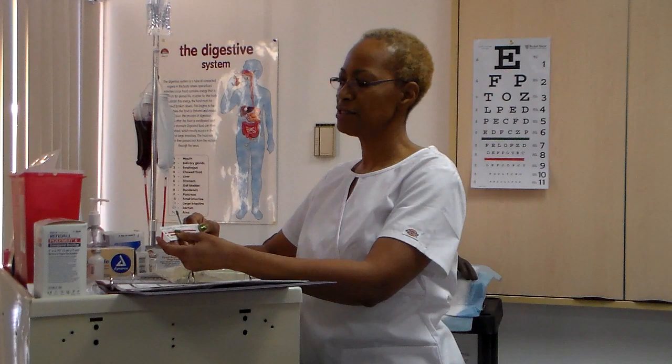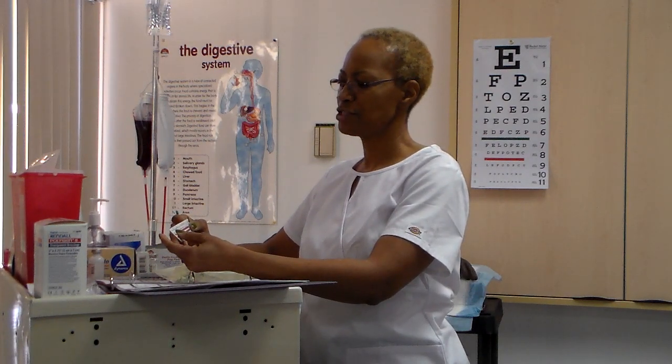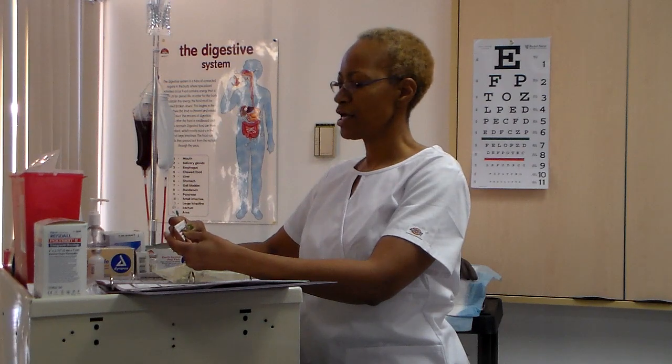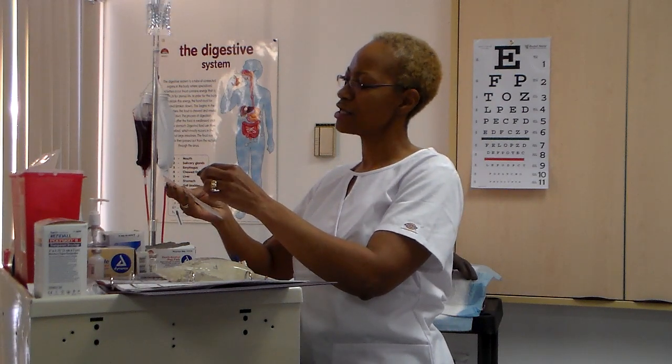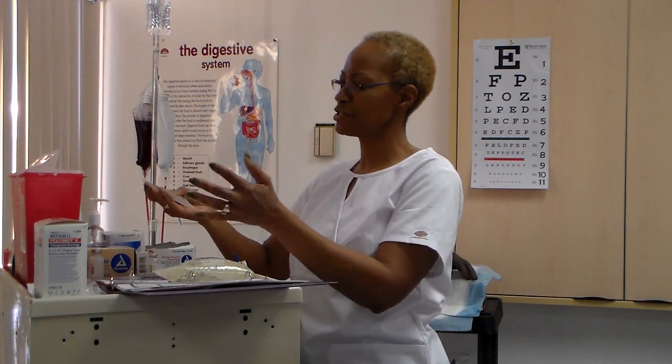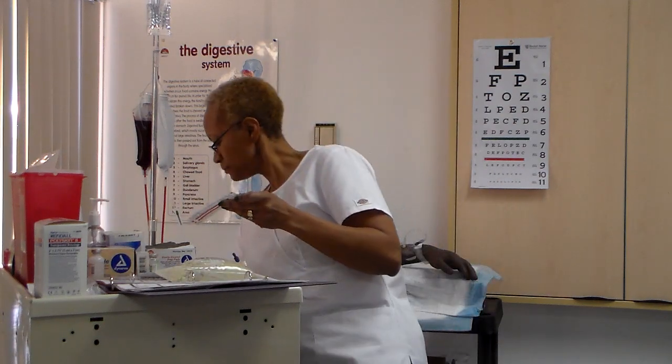So I've already completed my label, and you have your identifying information, your patient's name, your medication, what you've added to this bag, and your date, your time, and it has on here what bottle it is, like if it's maybe the third bottle for the day, so you can actually put that on there.